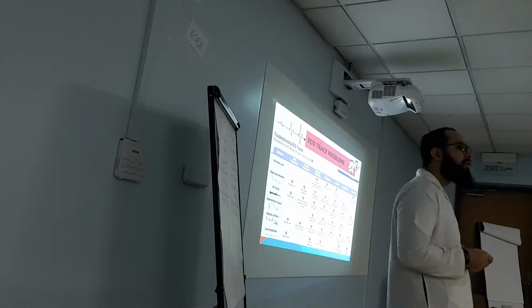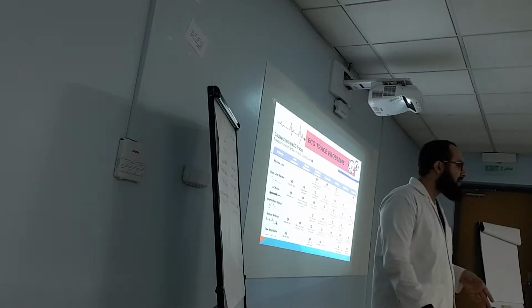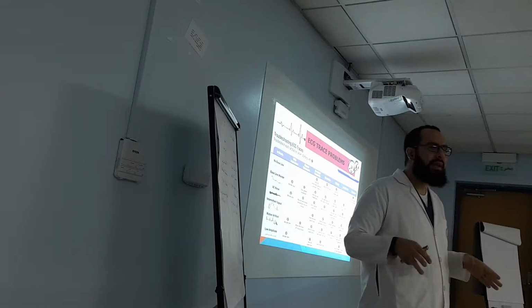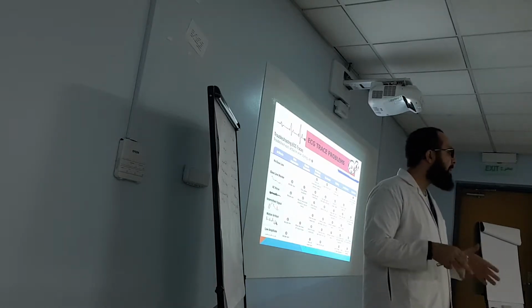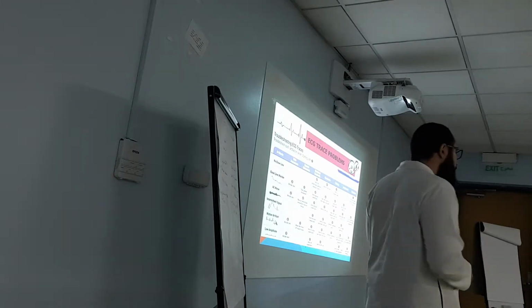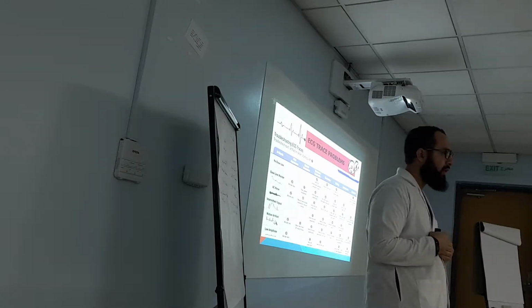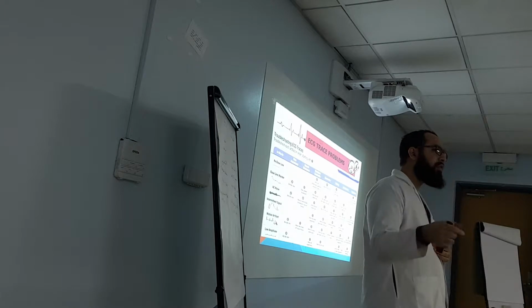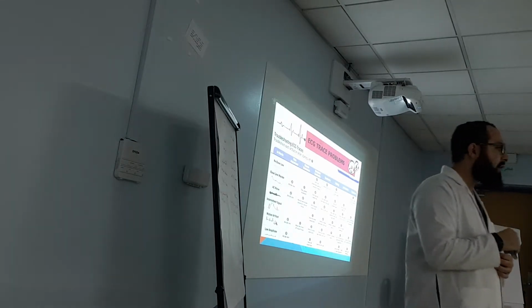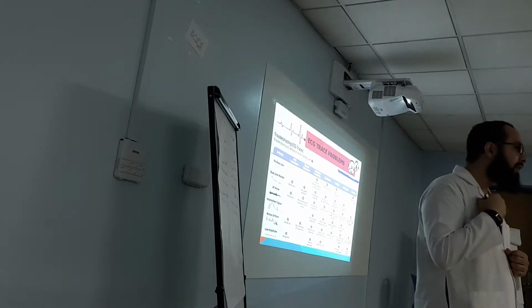Also, if you have devices like pneumatic compression, it causes some massage to the muscles, or some other devices, or a bed having a massage. This makes vibrations that affect your ECG. So we spoke about the patient, now also my ECG machine. What connects the machine to the patient are the wires and the leads and the modules. You have to inspect that those modules are connected properly, and you connect the leads in the right electrode.